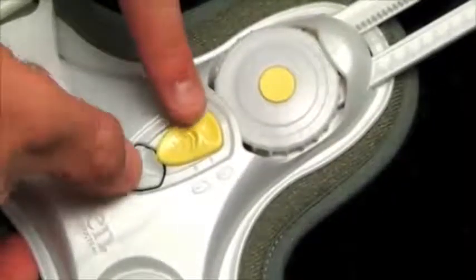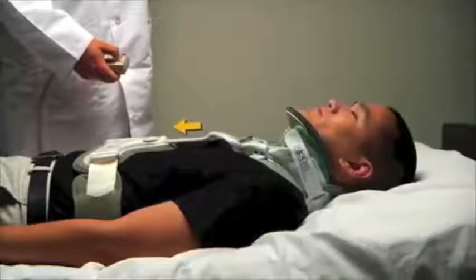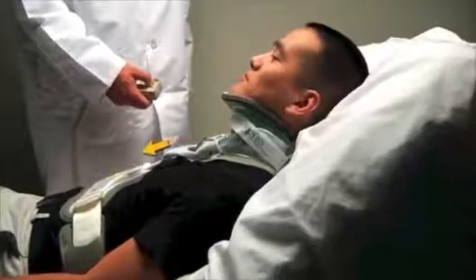The Vista TS adjustment points are easy to access for anatomical changes. This will ensure that patients will be comfortable and supported while laying, sitting, or standing.